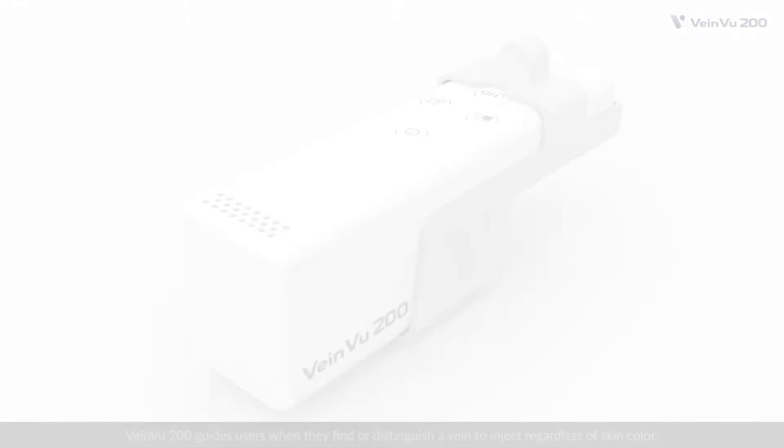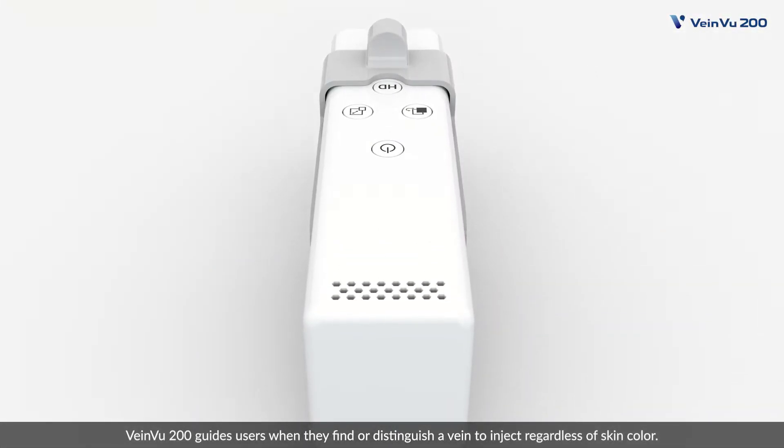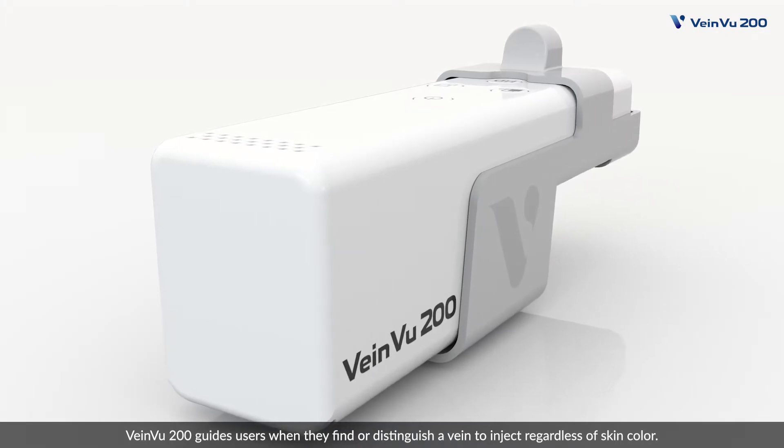Non-contact VeinViewer system, VainView 200. VeinVu 200 guides users when they find or distinguish a vein to inject, regardless of skin color.